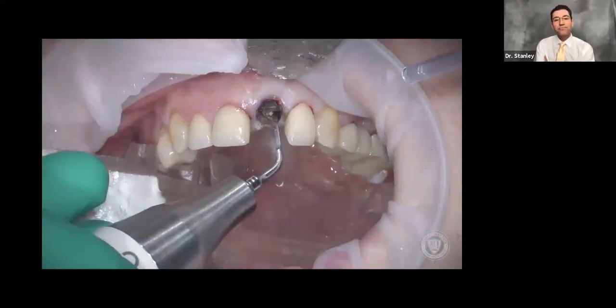Typically I use an ash forcep — sometimes called the parrot or bird beak forcep — because it provides a significant mechanical leverage advantage. For the video I'm using straight forceps so my hand doesn't block the camera, but the action is the same. We get down right around the neck of the root remnant and we rotate. As you saw in the video, it only took two rotations — one to the distal, one to the mesial — and the root remnant came right out. That's typically what happens with this protocol.